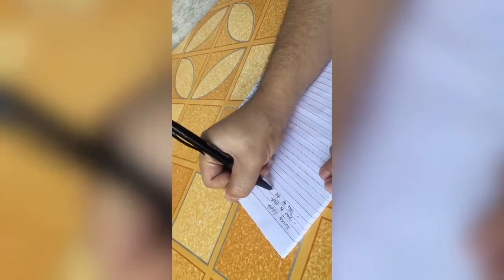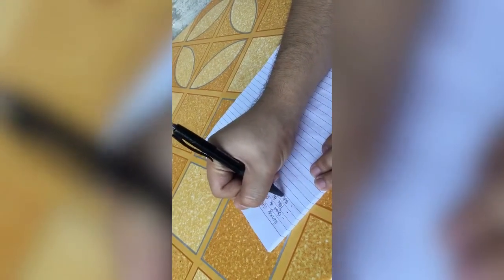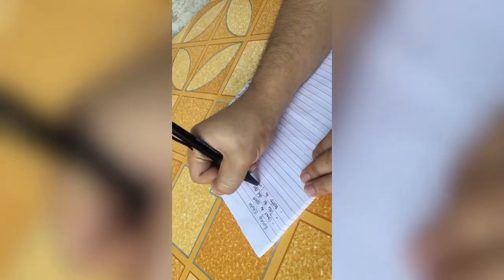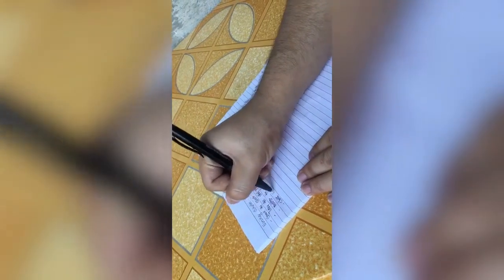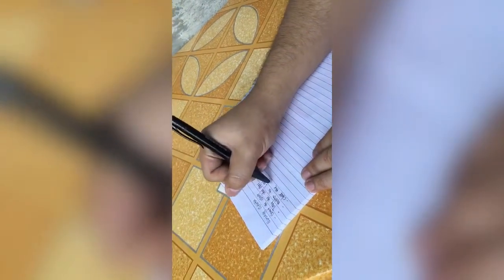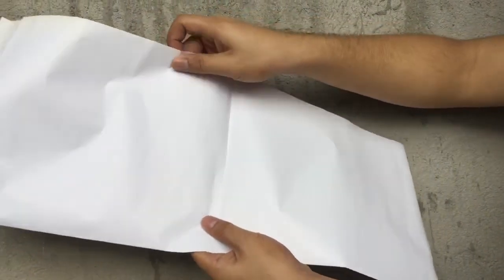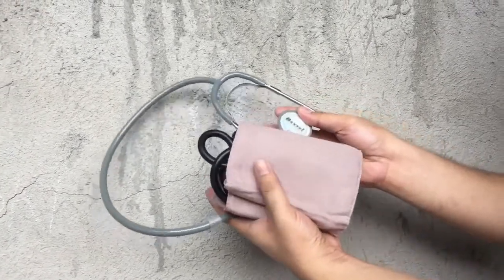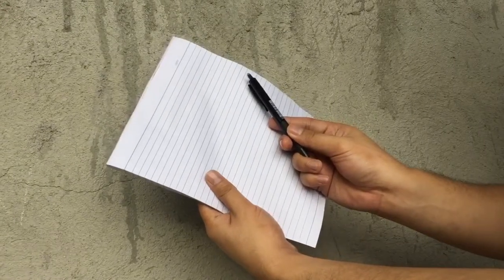Second is to plan nursing care activities before entering the room. This is to avoid going back and forth in getting the necessary equipment, and it provides you a one-way procedure and avoids cross-contamination in and out of the isolation room. Prepare a lining, BP apparatus, stethoscope, cotton balls with alcohol, and a piece of paper for the data to be gathered.